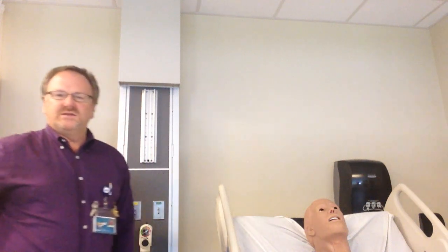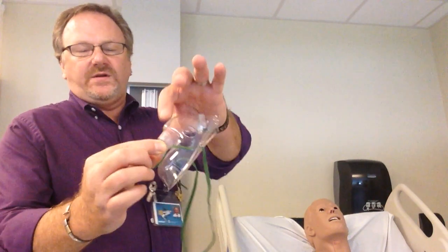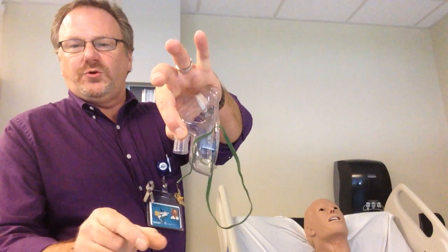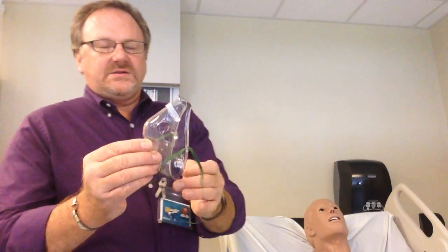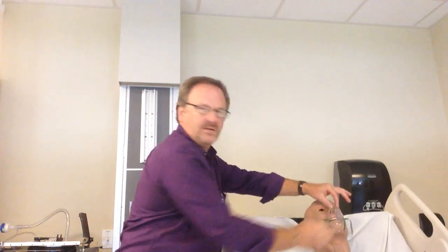Today we're going to go through high flow devices such as the aerosol mask, the trach collar, the face tent, and the oxy hood. The aerosol face mask looks just like the mask used for the venturi mask — the only difference is we do not have the large bore tubing with the venturi ports. It goes on just like a regular mask. Remember: do not put a mask on without flow going through the system, because you don't want re-breathing of carbon dioxide.